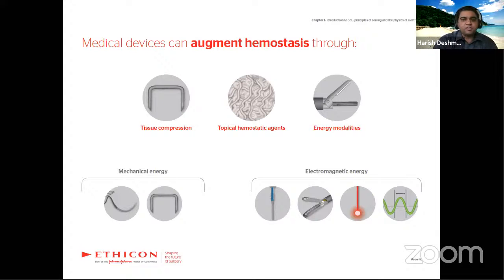We have different energy modalities like monopolar, bipolar. Then we have harmonic, and laser as well, when it comes to augmenting hemostasis.